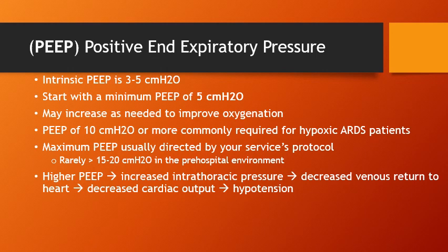PEEPs of 10 centimeters of water or higher are commonly required for hypoxic patients with ARDS. So don't be alarmed if you see PEEPs higher than 5 and often higher than 10 in those types of patients.